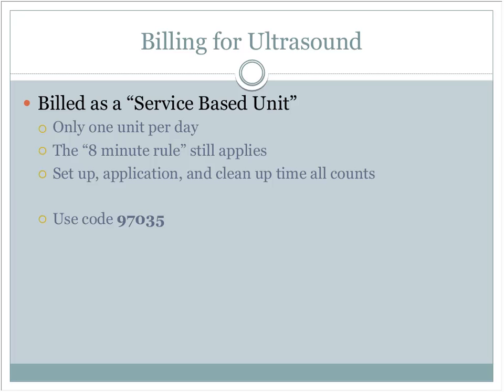So it's usually very easy to get at least 8 minutes because most ultrasound treatments should run for at least 8 minutes. Sometimes longer than that, depending on what you're doing.